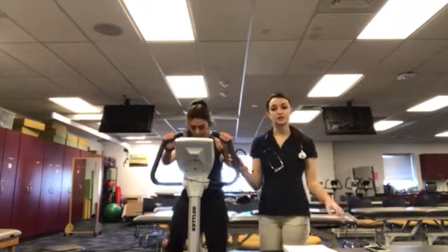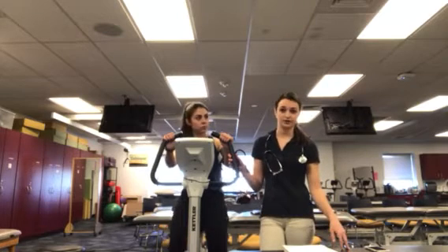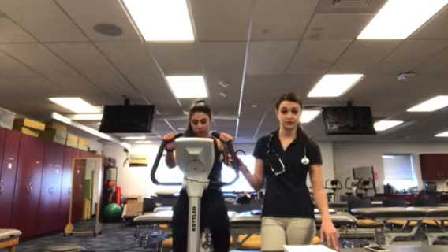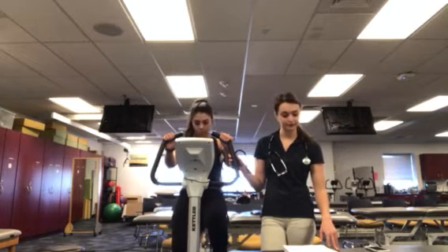Then after 2 minutes, I'm going to take her heart rate, her blood pressure, a second heart rate measurement, and we're going to look at Brooke's rate of perceived exertion on a scale as well.